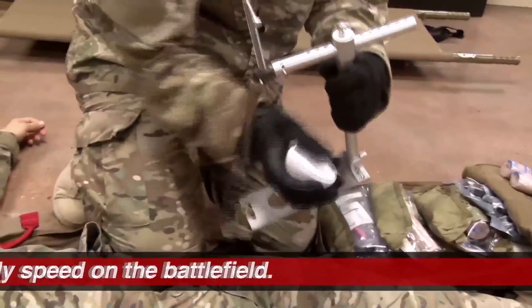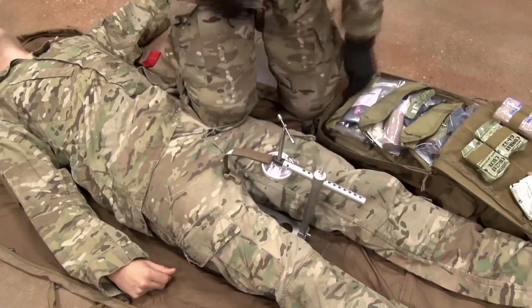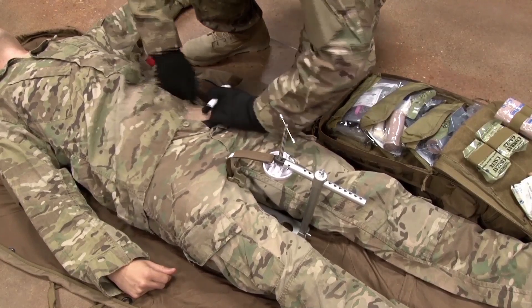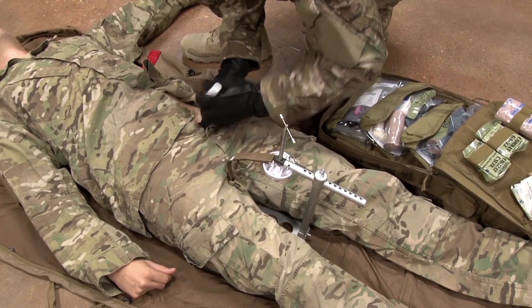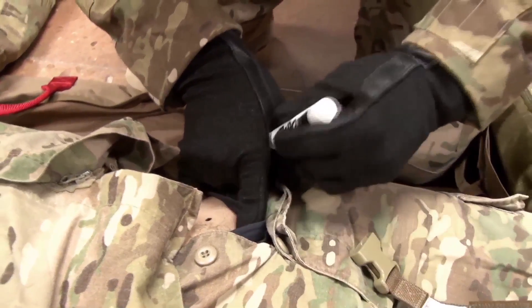Make the Croc. Locate the pubic tubercle and then locate the anterior superior iliac spine. Find the midpoint and mark it.